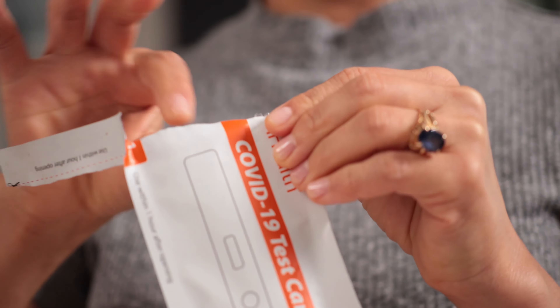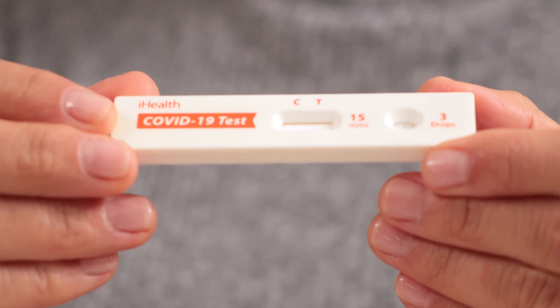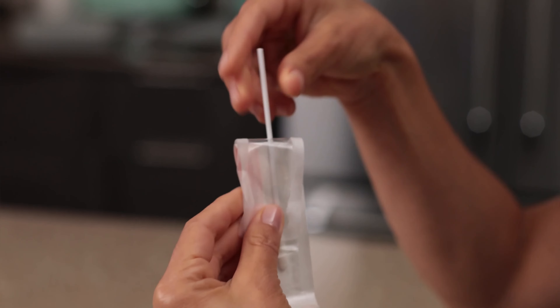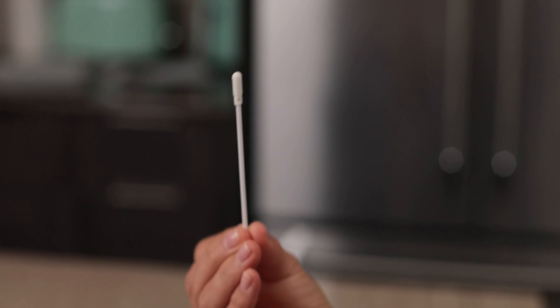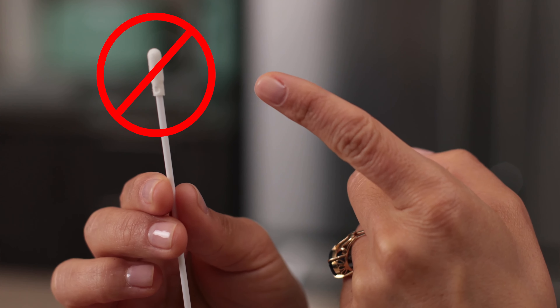Tear the foil packaging off your test card and lay the card upright so that it's ready to receive your test solution once you've taken a sample. Open the handle end of the swab package and pull out the swab. Be sure not to touch the swab end with your fingers or bring the swab into contact with any potentially germy surfaces.